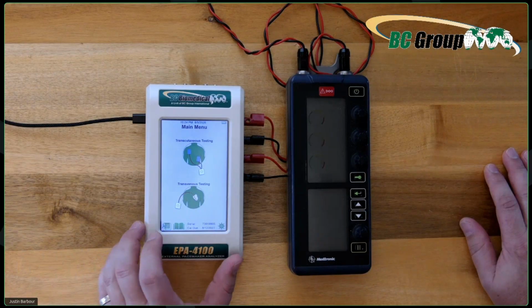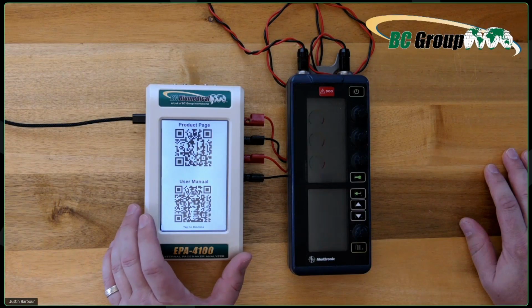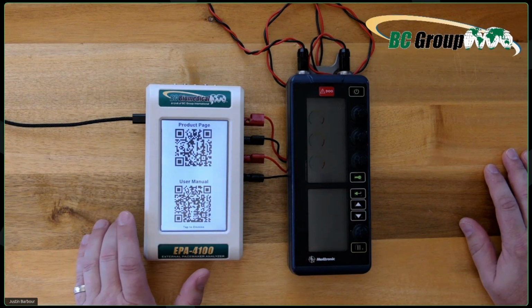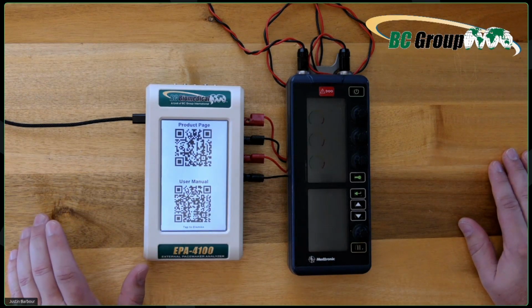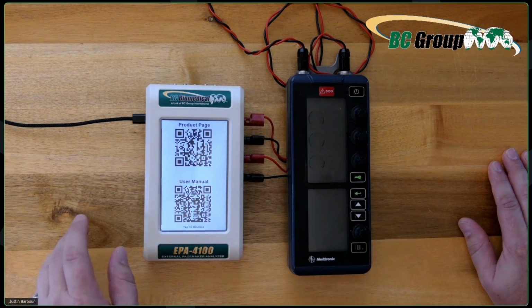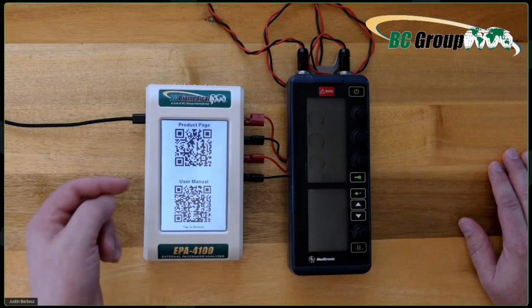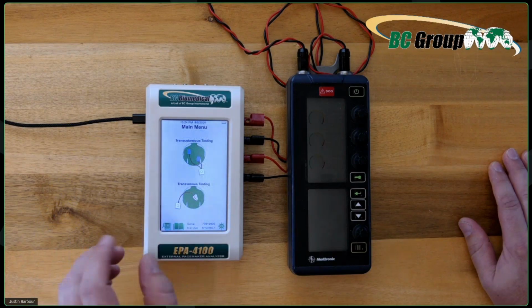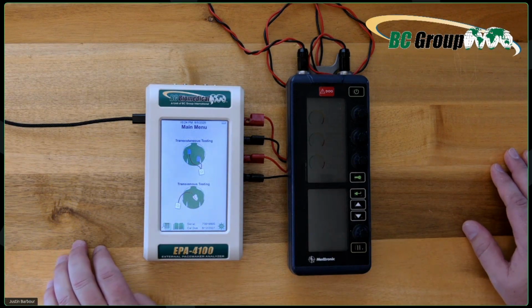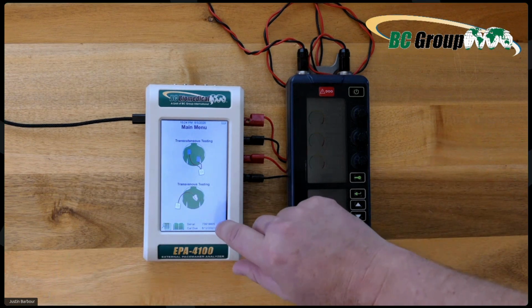On the main screen here, we have a button down here for your product page and your user manual. Now, these right here are just placeholders because, like I said, we cannot put a user manual online yet until it's in its final version. And when we do, that QR code will be valid. So the product page will tell you the stats on the product. We have onboard user manual. Just scan it with your phone anytime, anywhere, and you'll have full access to how to use that device.